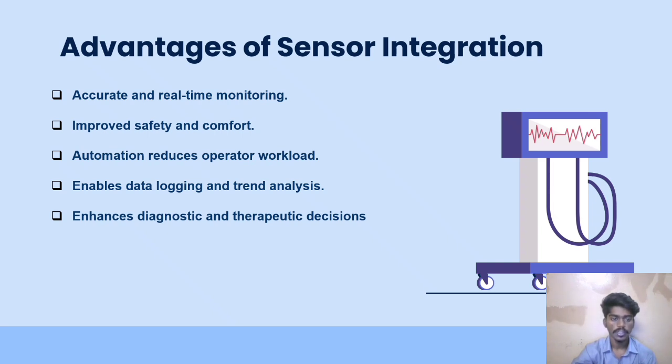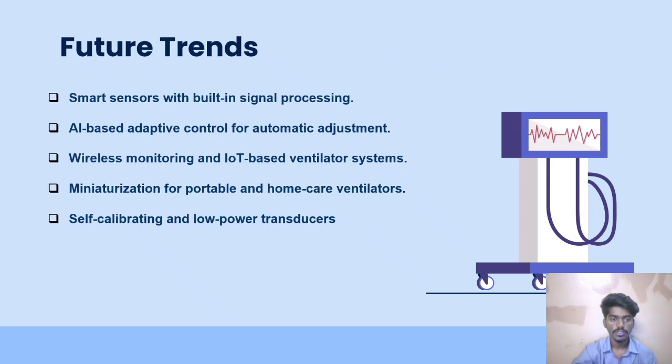Advantages of sensor integration. Accurate and real-time monitoring. Automation reduces operator workload. Enhances diagnostic and therapeutic decisions. Future trends. Smart sensors with built-in signal processing, AI-based adaptive control for automatic adjustment, miniaturization, and self-calibrating.